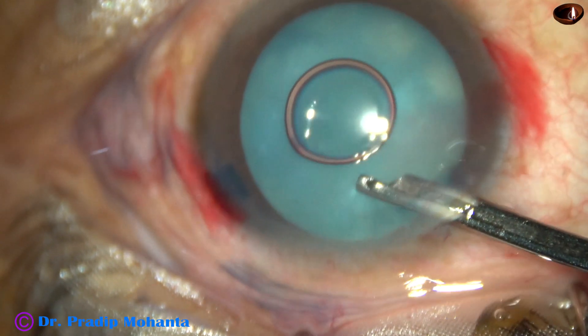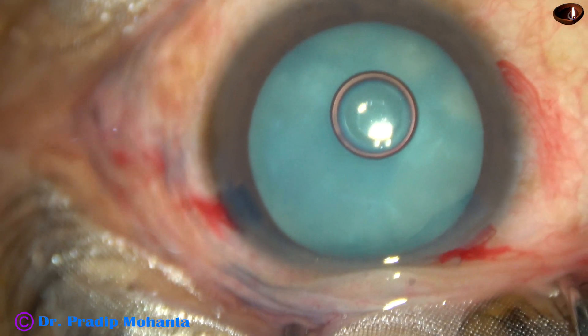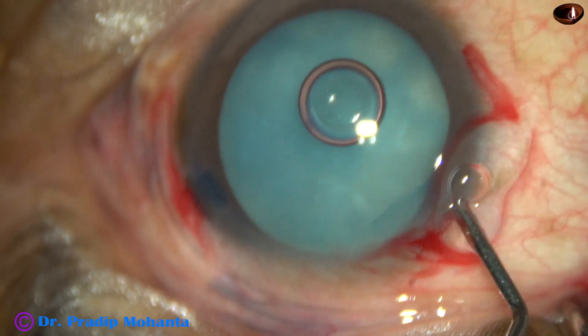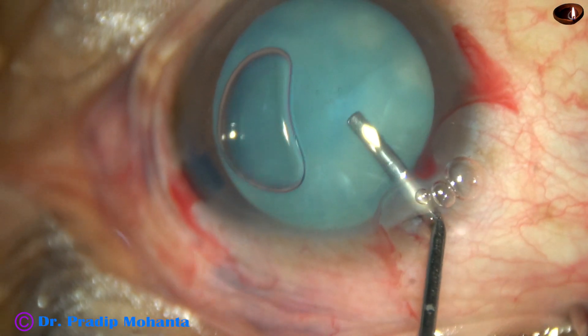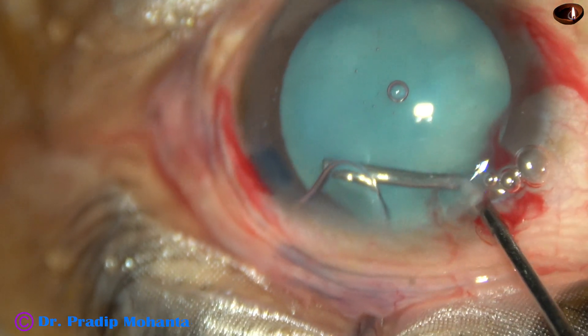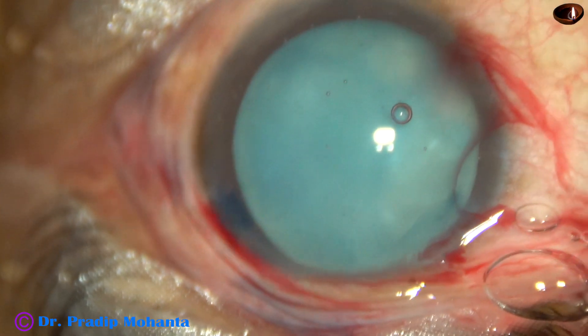And now the anterior chamber is to be filled with BSS. This is 2% hydroxypropylmethylcellulose filling the anterior chamber. The air bubble must be expressed out and replaced by the viscoelastic, otherwise it can cause some disturbance in capsulorhexis.